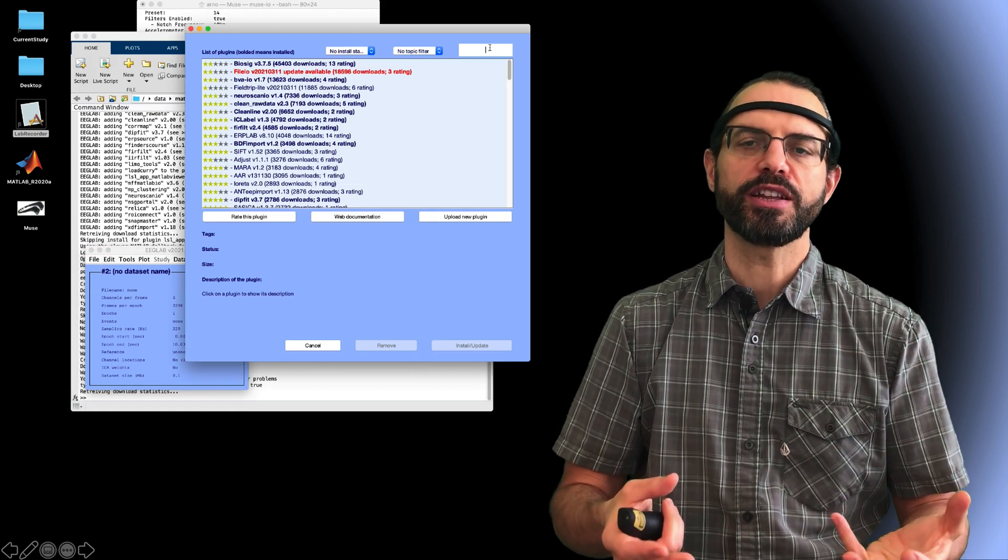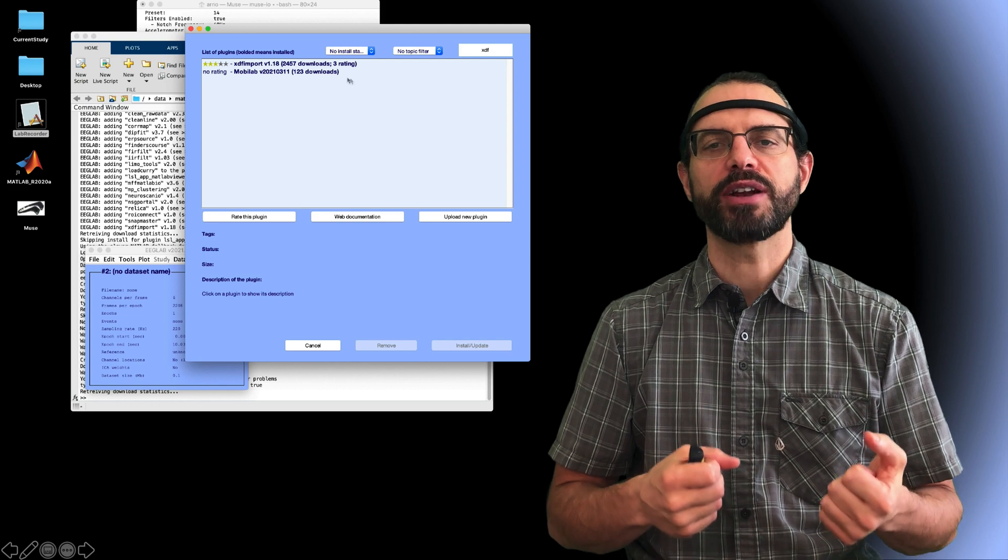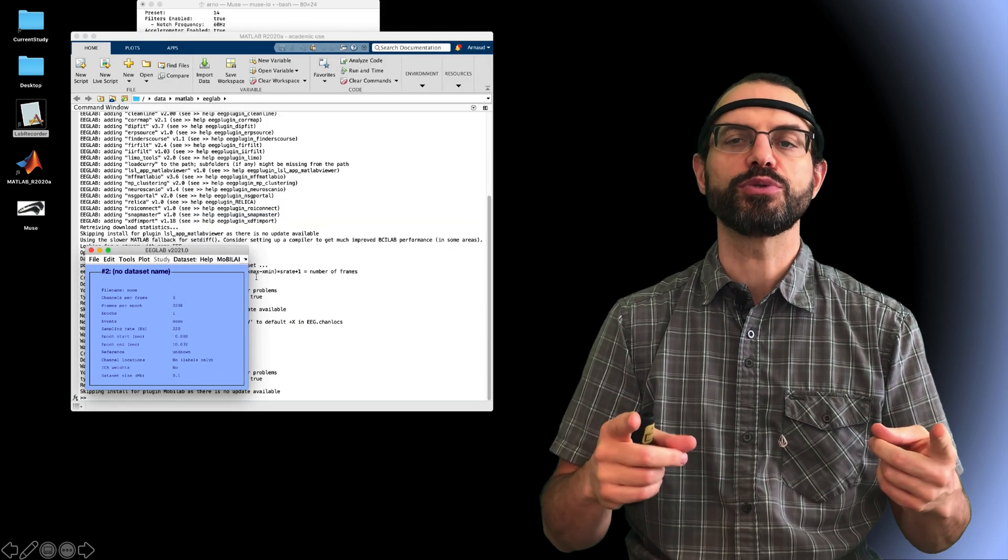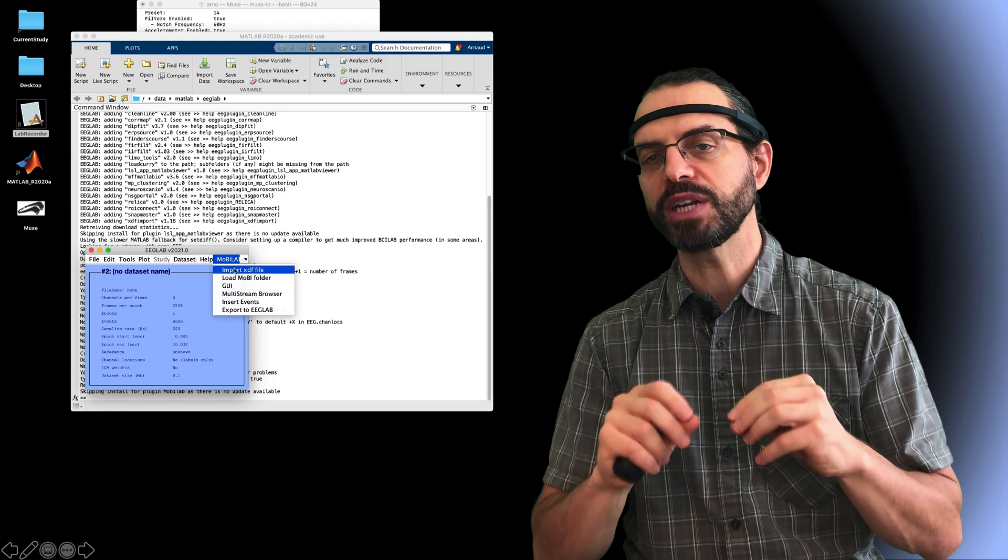First, we need to install the plugin, of course. This plugin will allow you to select different streams and align them, to resample them, to match the EEG sampling rate.